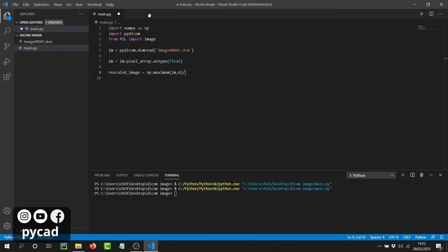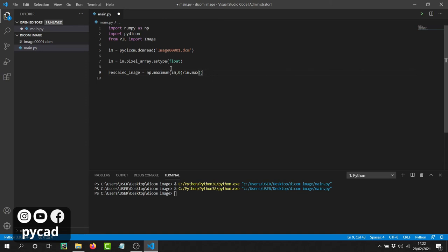After removing negative values, we need to rescale — putting all pixel values between 0 and 1 by dividing by the maximum value of the image. After dividing, we have values between 0 and 1. But to create an image we need values between 0 and 255, so we then multiply those values by 255. Now the maximum pixel value is 255, which corresponds to white.